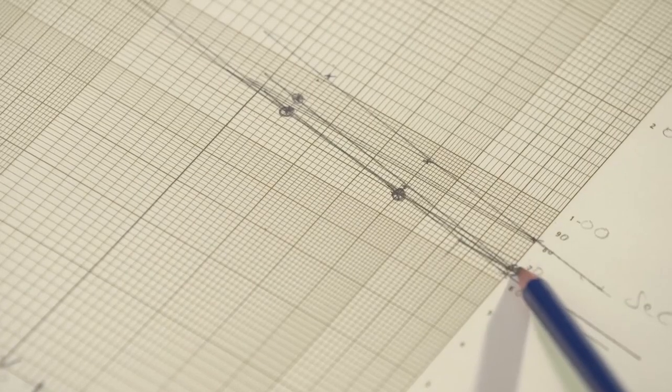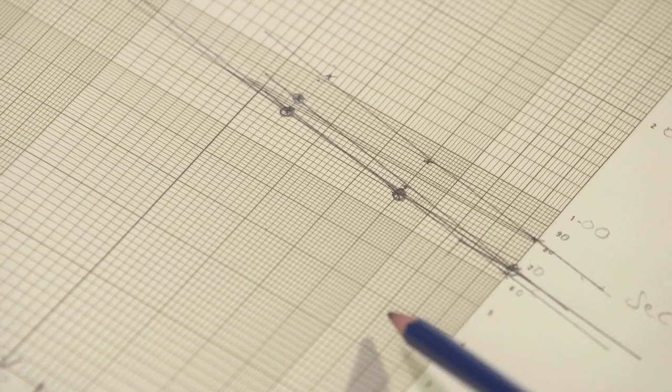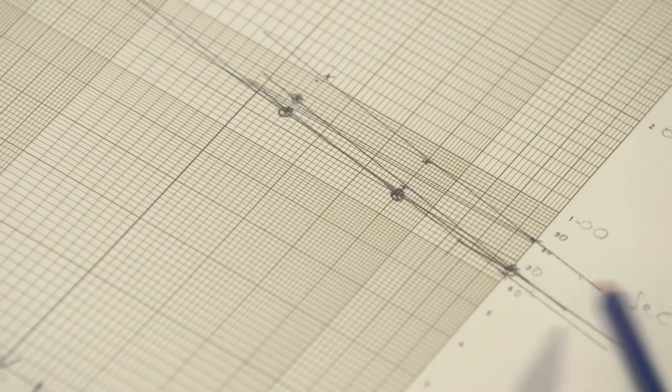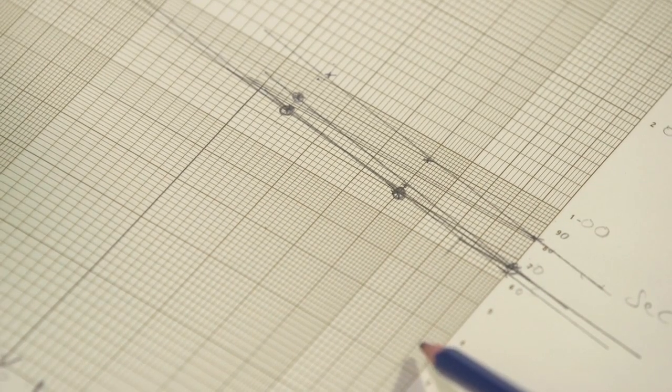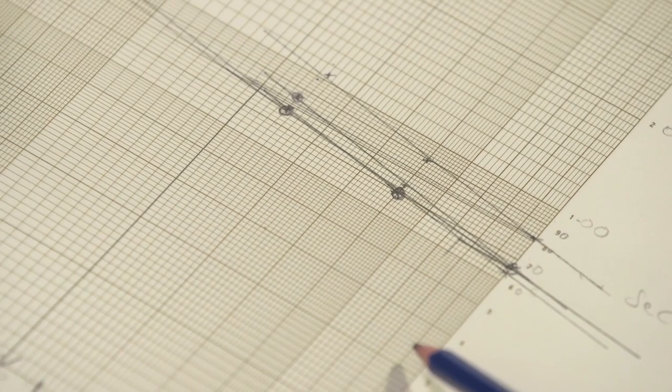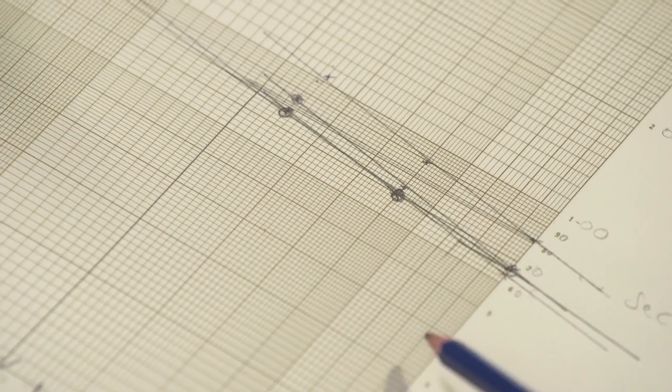So what's happening here? In the 1 in 10 dilution, the antibody is able to prolong the clotting time, a false prolongation. It elevates the clotting time by removing some of the phospholipid sites for the reactions. The reactions run slower, the clotting time is falsely prolonged. So we get a false elevation.